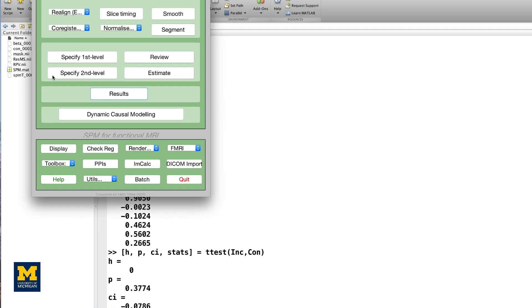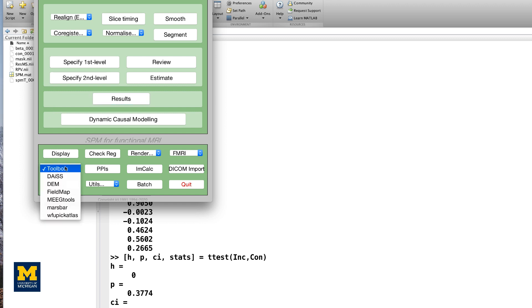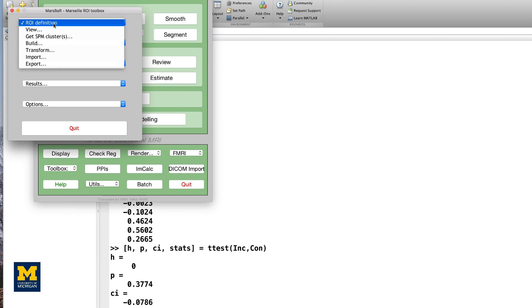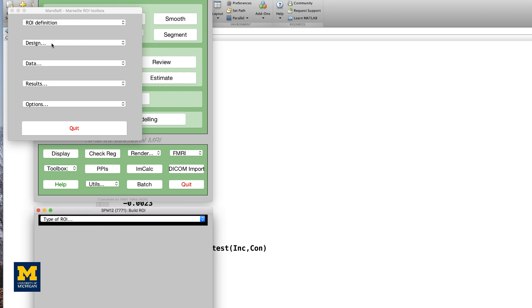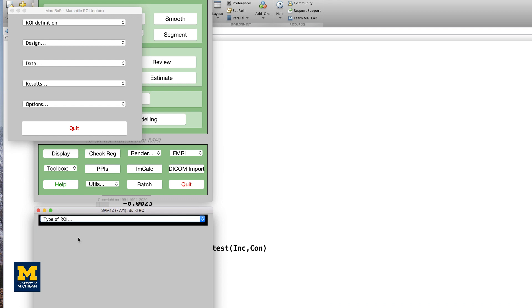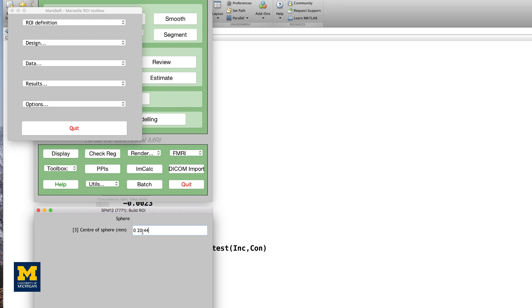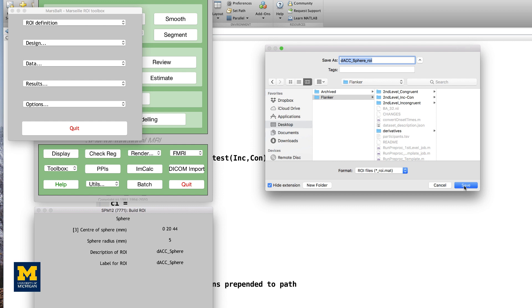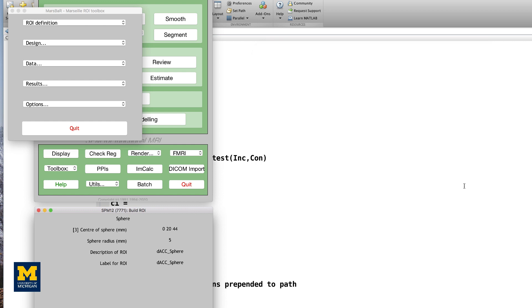To create this sphere, we will be using the Mars Bar Toolbox that we installed in the last chapter. From the SPM GUI, click on Toolbox and select Mars Bar. To create a sphere, click on ROI Definition, Build. From the Type of ROI drop-down menu, select Sphere and enter the coordinates 0, 20, 44. Enter a radius of 5, and for both the description of ROI and the label for ROI fields, enter DACC_Sphere. Save the file to your Flanker directory as DACC_Sphere_ROI.